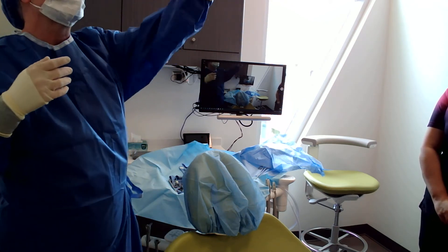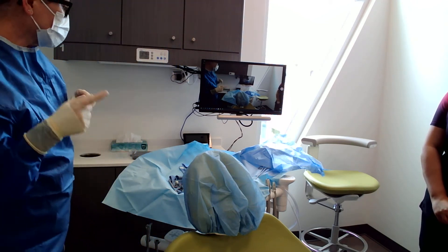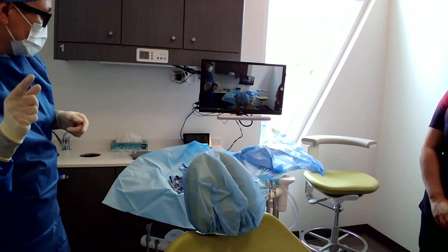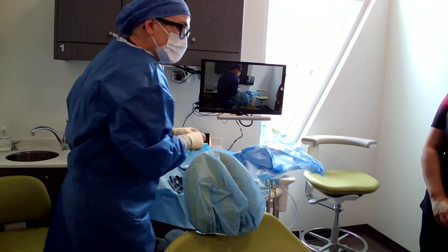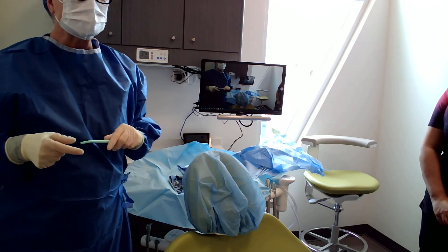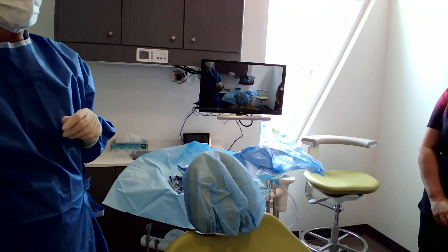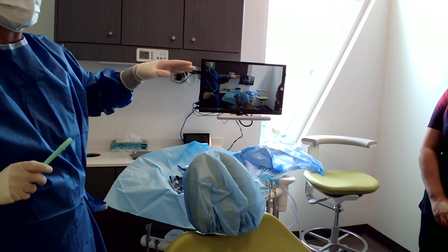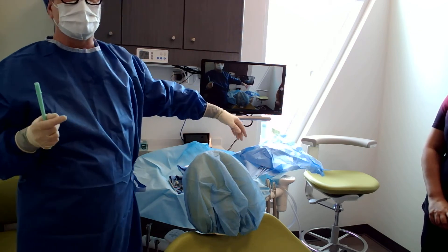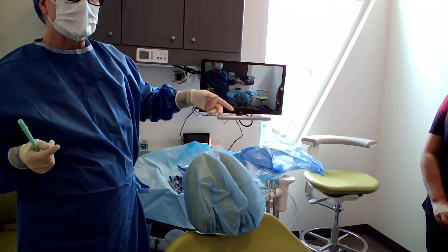Nina is here to turn on the suction, turn on my light, open stuff, and be a runner if I drop something. If Courtney was going to be asleep, the RN could sometimes help, but it's better to have another set of hands — especially if there's a lot of bleeding and you need a lot of retraction. I can't fill up my syringes while suctioning; I need Nina at that point. She might even have to scrub in for part of the surgery to help.